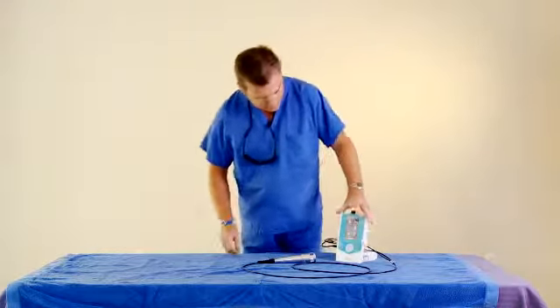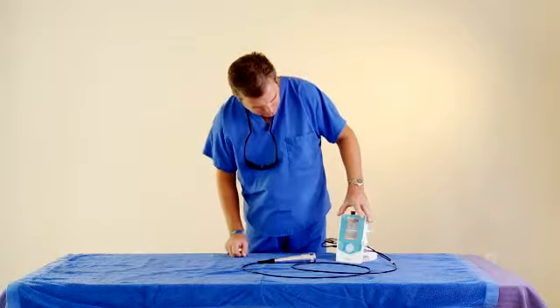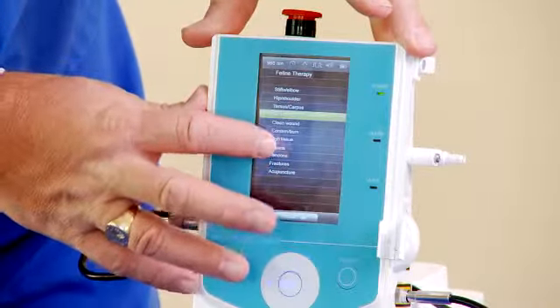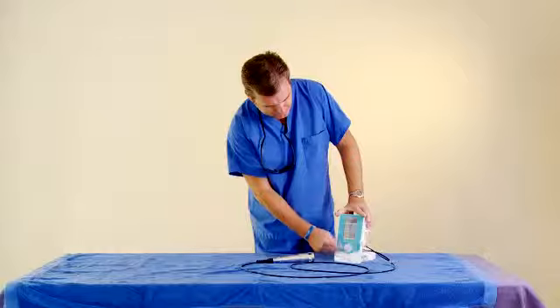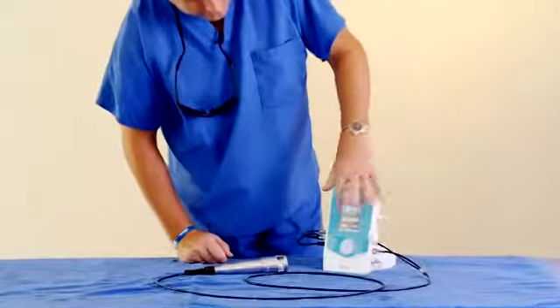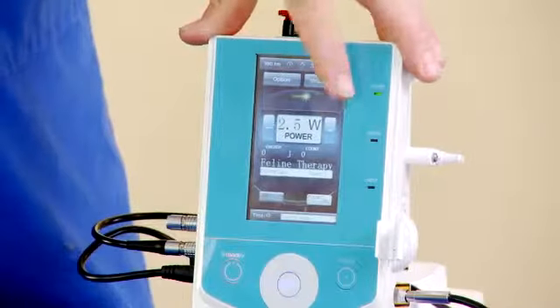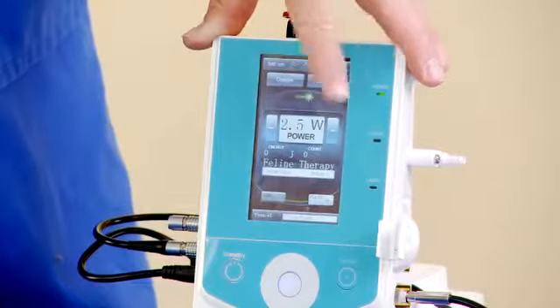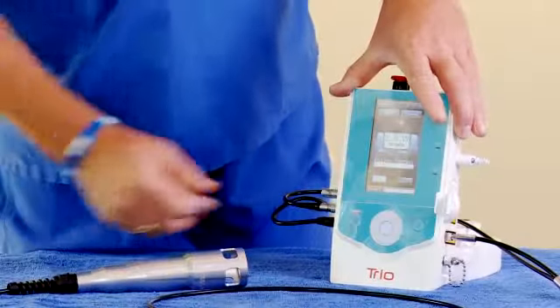Some of the other features of the laser: as you go through each species, you do have a protocol for different treatments for the animal. Once you find a treatment that you want to execute and use on the patient, hit enter. This is the base wattage that would be for a typical patient. You can turn it up or down depending on the patient. We'll discuss that in the next section.